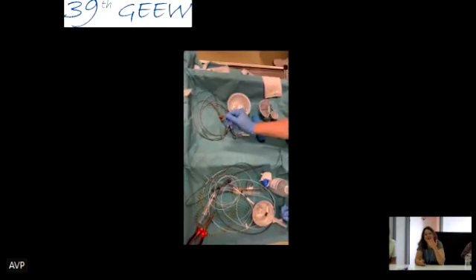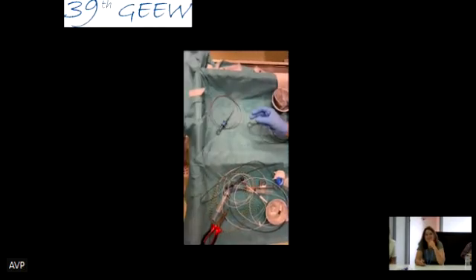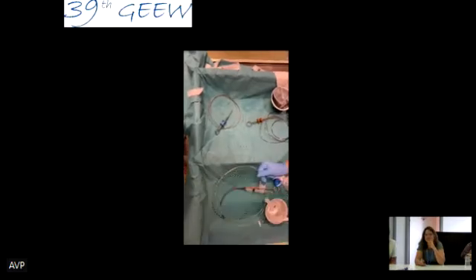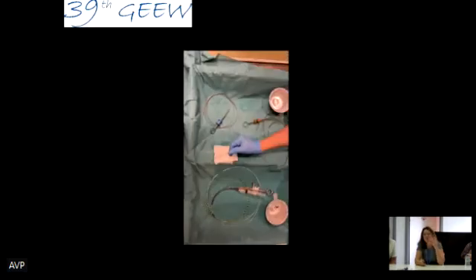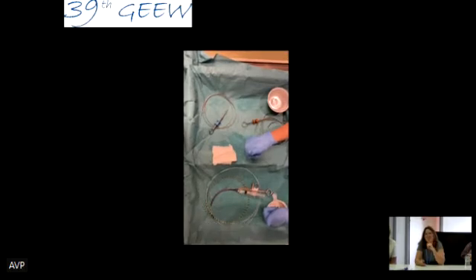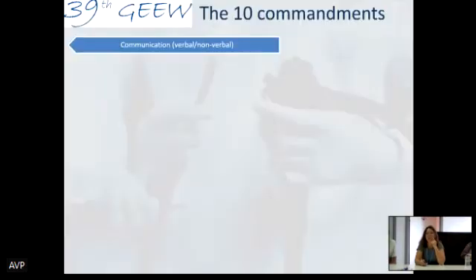So a little bit of magic. And things seem to be getting better. So you get rid of everything you don't need, the big boxes, everything can go underneath. You keep everything looped on the right, on the left side. I've learned that the water is on the right side, but you know, really how to organize your table can help you. It can really decrease the time of a procedure.